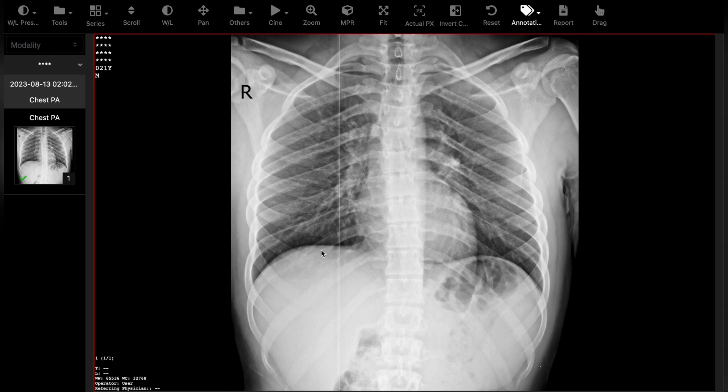The normal diaphragm's border is regular and no air can be seen below or above it. If there is any hollow viscous perforation, the free air will be seen in the subdiaphragmatic area on chest x-ray, which I'll show you later.